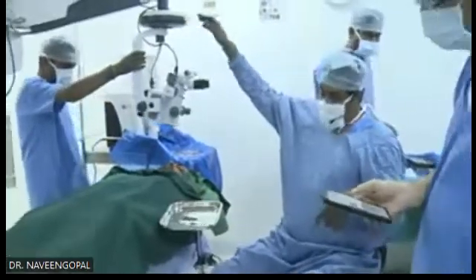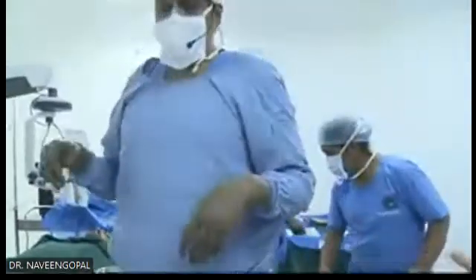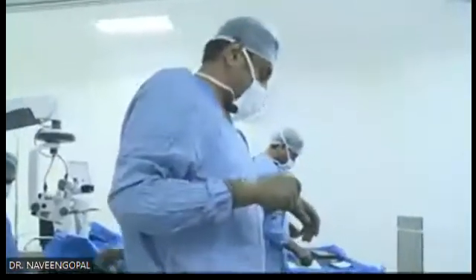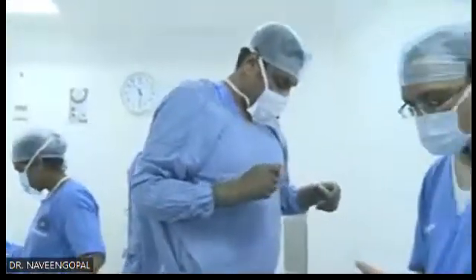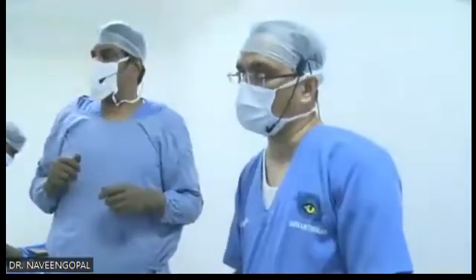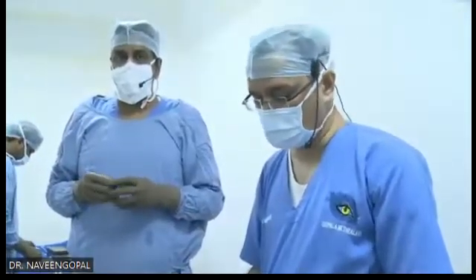Yeah, you can close. No problem. You can close. The most preferred viscoelastic is HPMC. Why? Because it is easy to wash, and chances of post-operative IOP spike is very less compared to sodium hyaluronate or any other high viscosity viscoelastic OVDs.